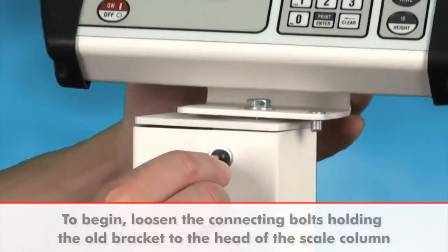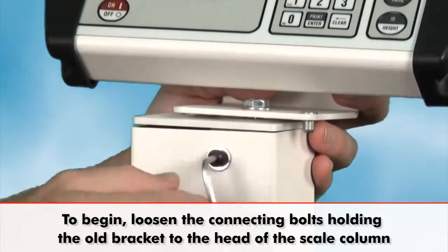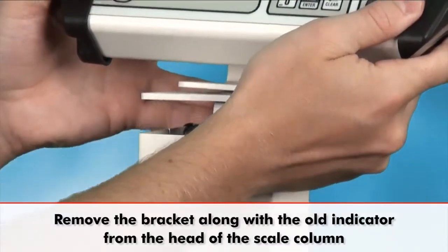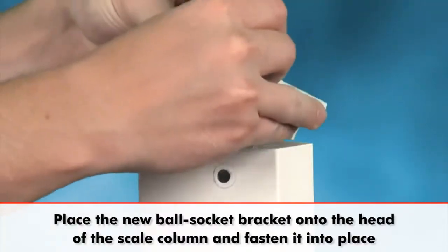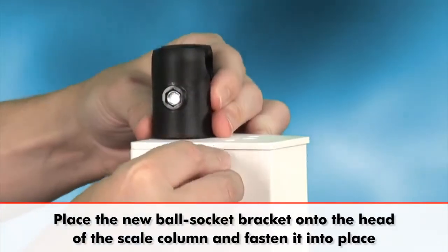To begin, loosen the connecting bolts holding the older bracket to the head of the scale column. Remove the bracket from the scale column, place the new ball socket bracket onto the head of the column and fasten it into place.